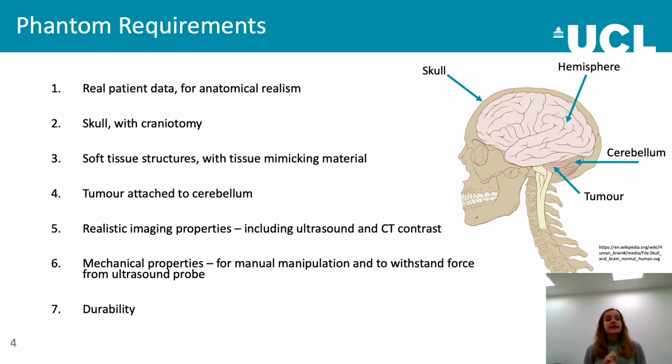Then finally, the phantom needed to be durable so that it could be used multiple times and stored for weeks or months in between uses. So bearing all of those requirements in mind, I decided to create a skull just by 3D printing it in solid plastic. We used PLA.